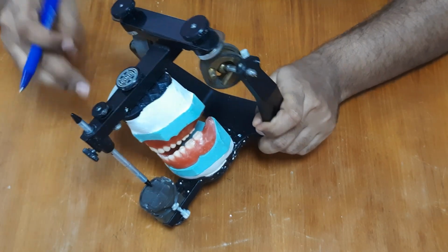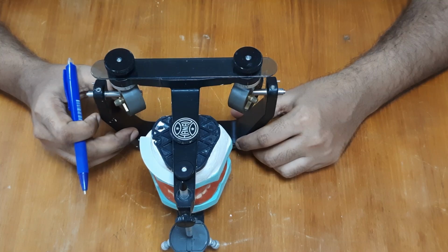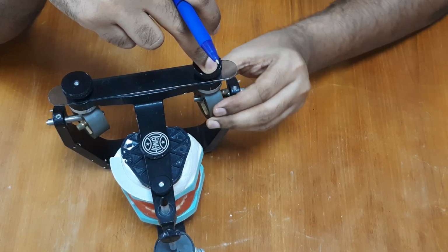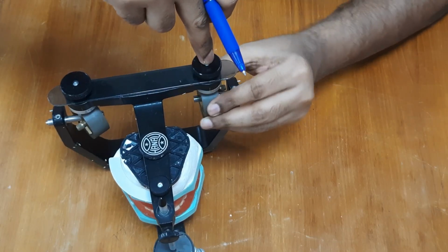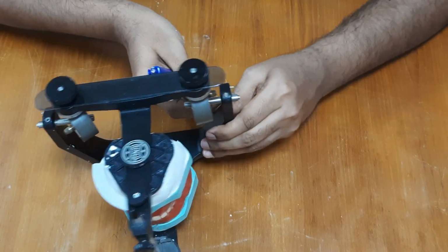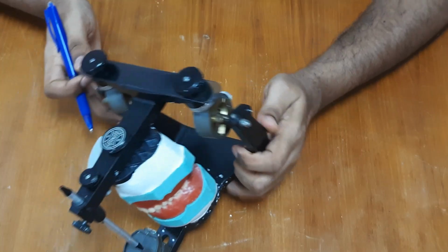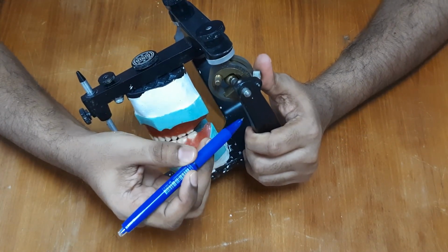This can be rotated in two axes. It can be rotated around a vertical axis and also around the coronal axis. So this condylar guidance is a circular structure.